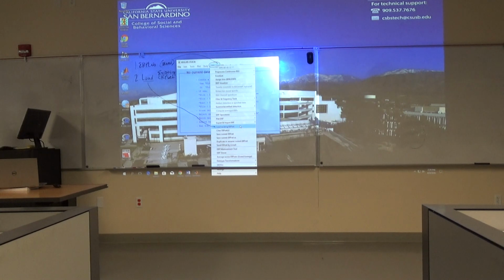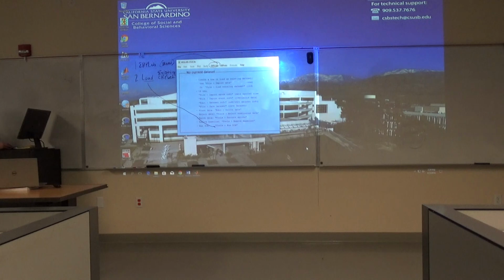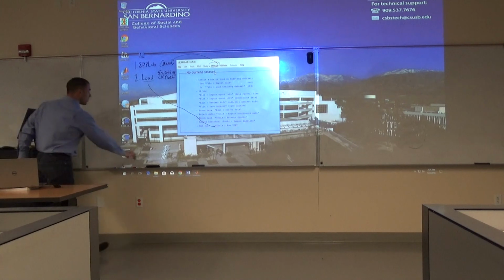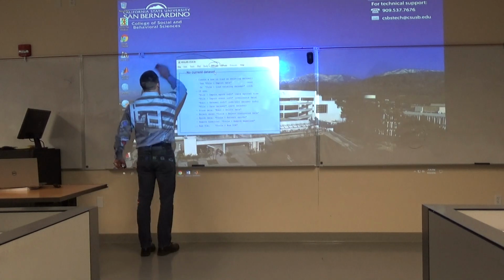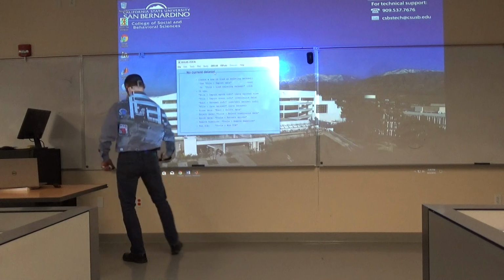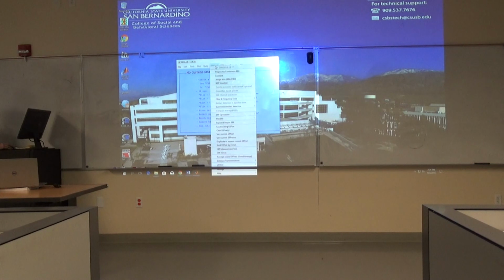You guys all follow that? And when you do that, it should take you to the ERP file we downloaded, right? So once you snag that, hit open. And then when you do that, you hit open. Now we can come back to ERP Lab.